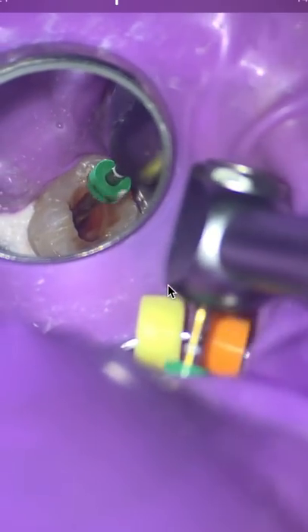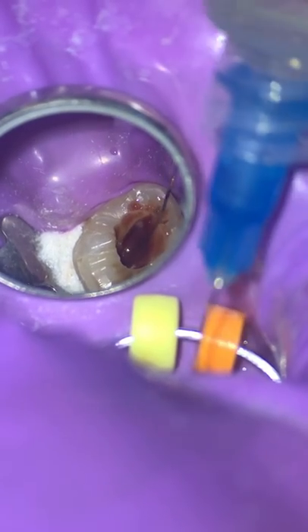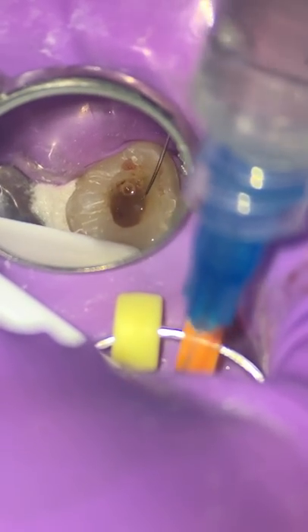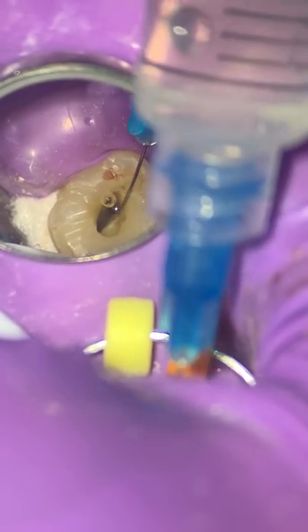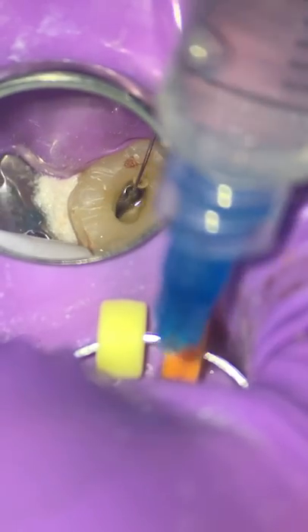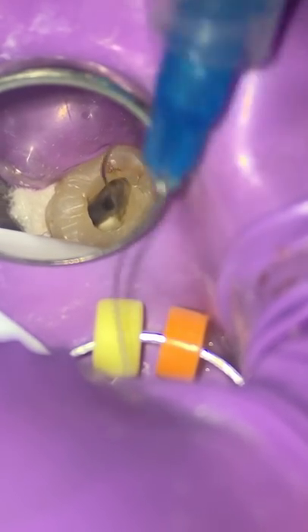What this is doing is trying to break up vital tissue, but also trying to stop that bleed in the buccal canal. And if the hemorrhage doesn't stop, then I've got to do something else. So now I'm confident that it's not excess pulpal tissue in that canal. I feel that it's debrided well enough. You could argue that sodium hypochlorite has not been in that canal long enough to stop the bleed. But my experience has been that if I haven't been able to get it stopped after this amount of time, it's going to be pretty tough. And it looks like it's stopped, but it's one of those slow weeping bleeds.